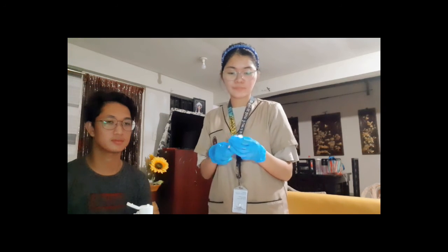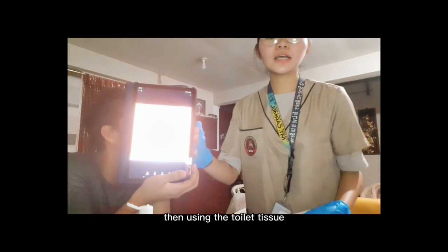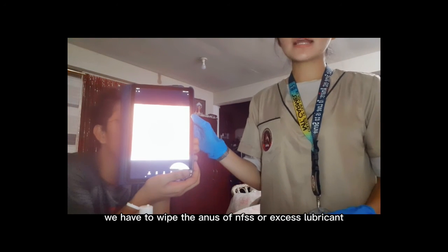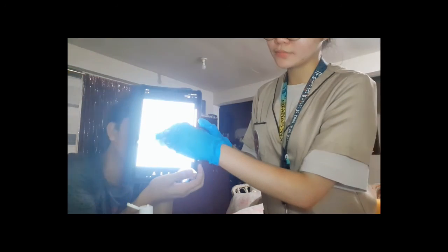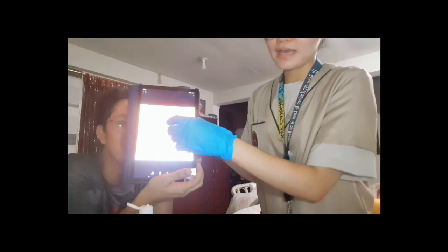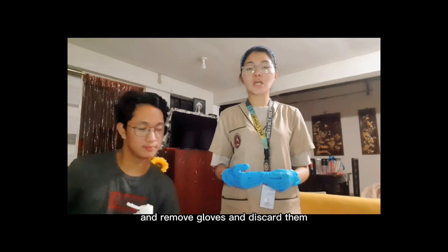Okay. Then using the toilet tissue, we have to wipe the anus of any feces or excess lubricant. So here. Okay. Then again, dispose the toilet tissue and remove gloves and discard them.